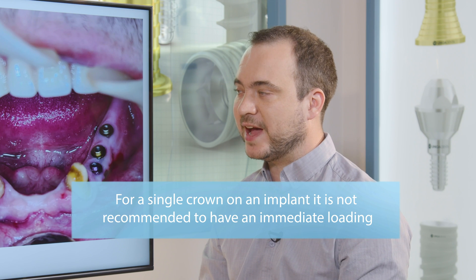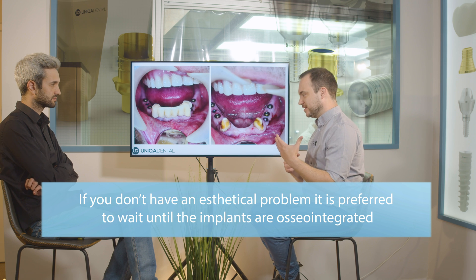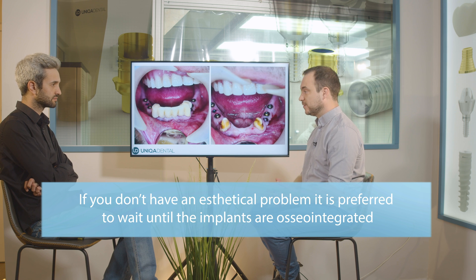If you have a full arch, there are cases when you can immediately load, but the only advantage of immediate loading is the immediate aesthetics for the patient. So if you don't have an aesthetical problem and the patient has some kind of bridge, you can make the implantations and wait for the osteointegration — it's always better. If the patient doesn't have any aesthetical requirements, or if they've been going with two canines and a small bridge for a couple of years, another three months won't be an issue. And if the patient has health issues or age-related diseases, it's better to wait for complete osteointegration.